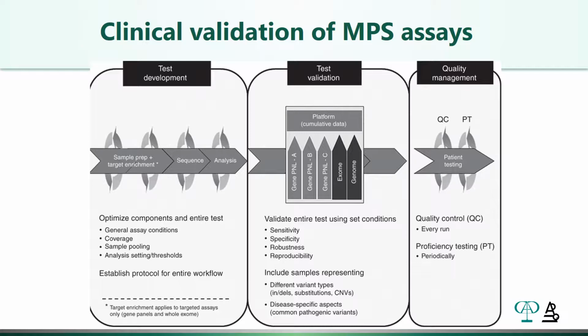Regardless of what you're using, though, for your MPS assay, you need to go through the steps of clinical validation. And this really isn't specific to NGS. However, it is a little bit involved when you're doing an MPS assay validation. Think about the clinical validation as dividing into three major areas. There's the test development, then there's the test validation, and then there's the ongoing quality management of the assay.